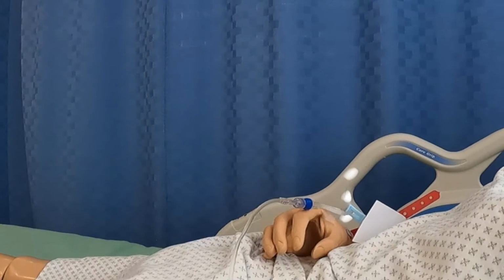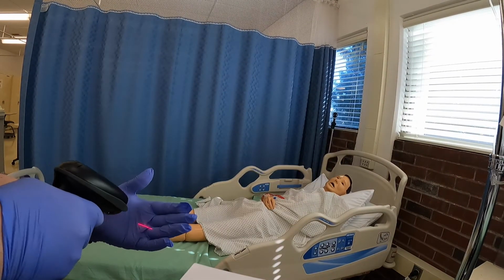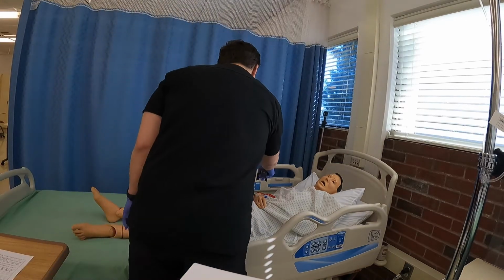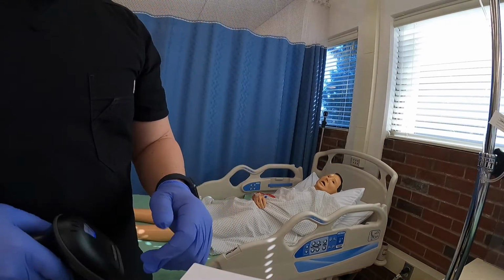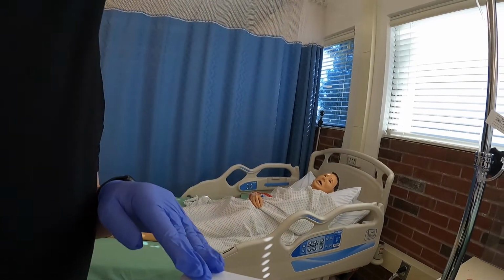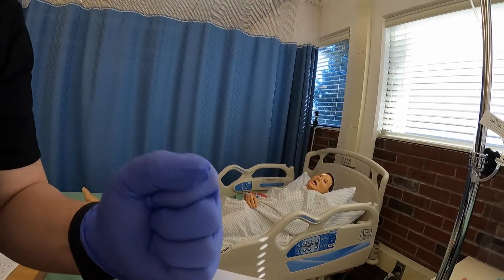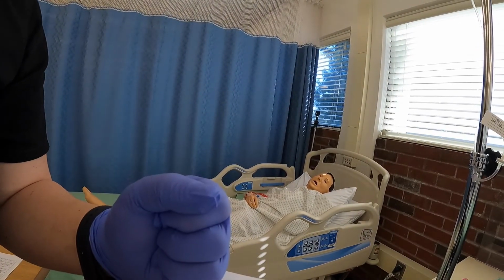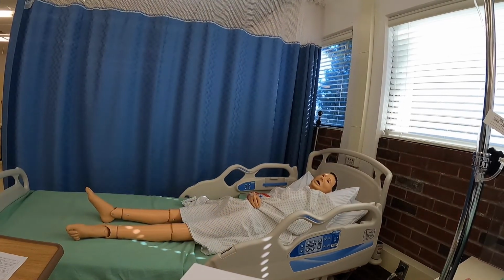And now it's hooked up to the patient, and I scan the patient. So again, I'm going to do my third check right here. Alan Covey, birthday, allergies, I've scanned him. Then I'm going to scan the barcode of my IV. Perfect. I'm going to make sure I do all my 6 rights: right drug, right patient, right dose, right route, right time. And then I gave him his education. Completed my 3 checks.